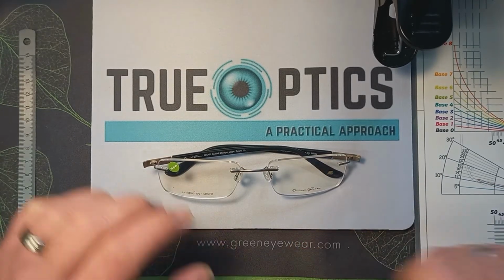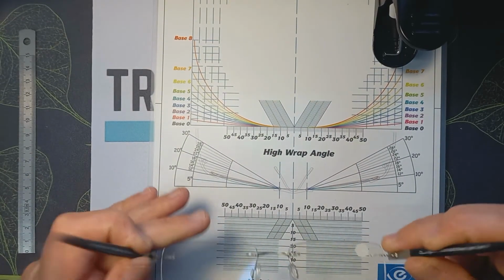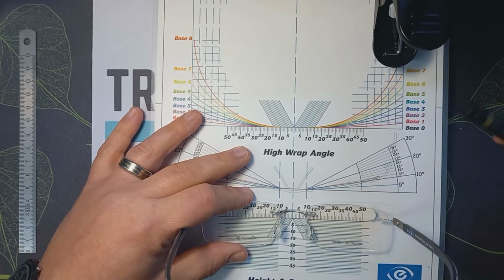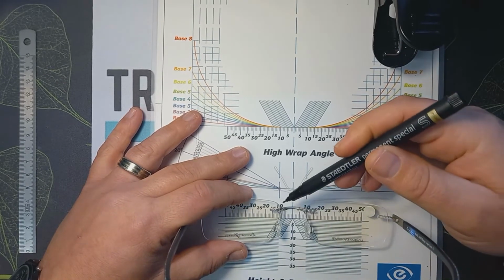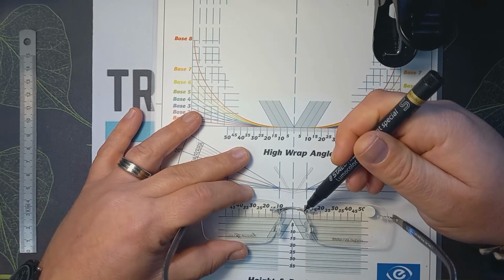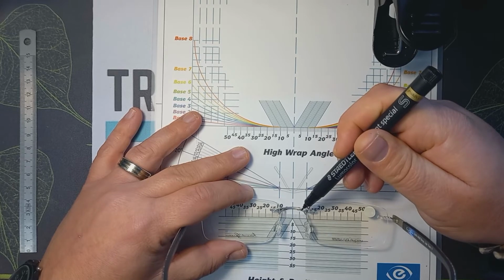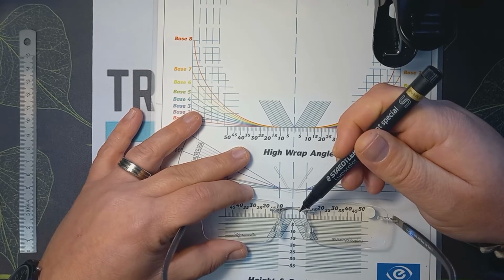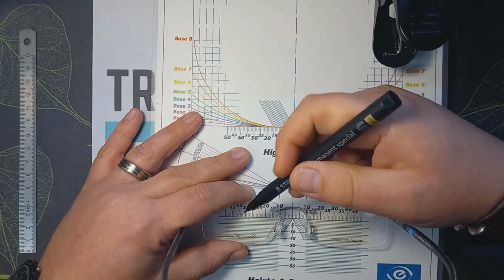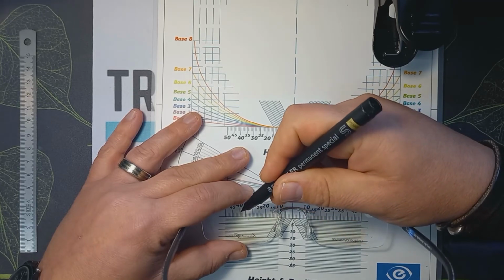All right, now you're going to have to take your chart. You're going to align your frame as accurately as possible on your chart. I like to use my nose piece as a reference point. I always like to make sure that those corners match each other. Then I know my frame is aligned well. So we know now that our frame PD is 75. Divide that by 2 and you get 37.5.